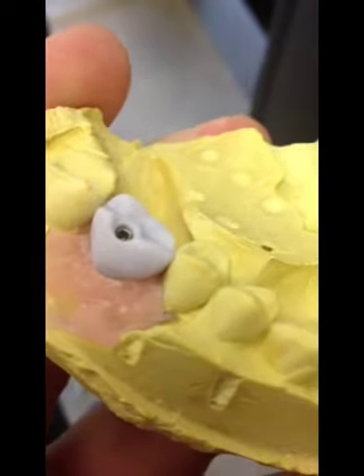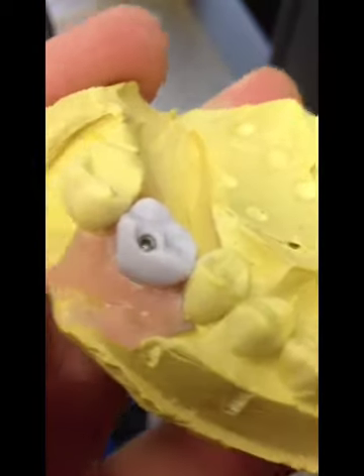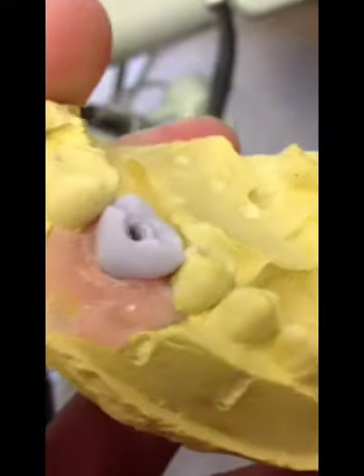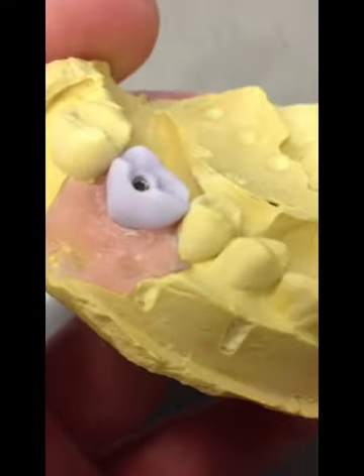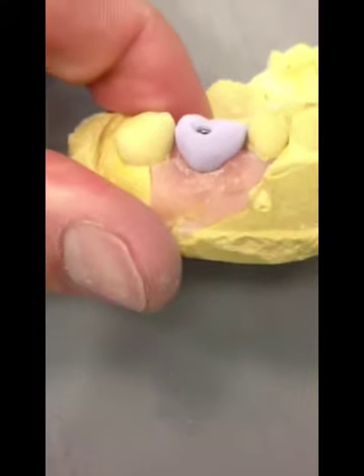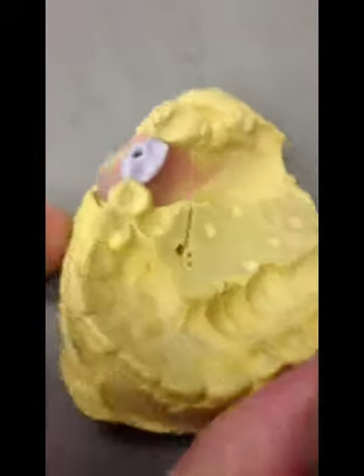Obviously you can see that once we seat this, just like we normally would, we're going to put down a cotton pellet, and then we're going to fill the top over with composite. If you're wondering why the crown's purple, then you haven't done a whole lot of milled crowns. Check out another video about that, because we haven't fired this yet. We're still on the phase of try-in and making sure that everything fits right. Okay.